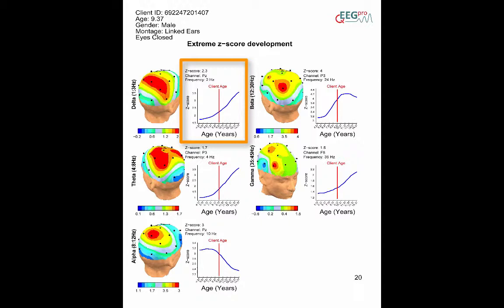This information can be used to form hypotheses about the neuropsychological origin of the deviant activity. In the current example, it could be hypothesized that the deviant activity at 2 Hz at pz is caused by a maturation lag.